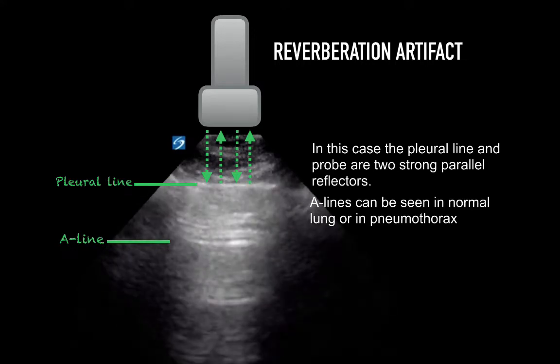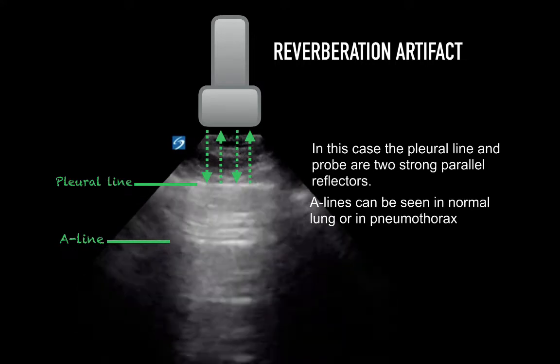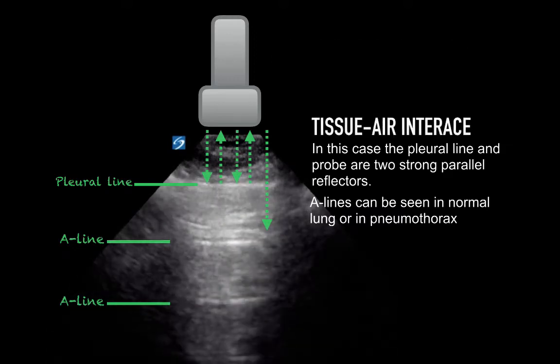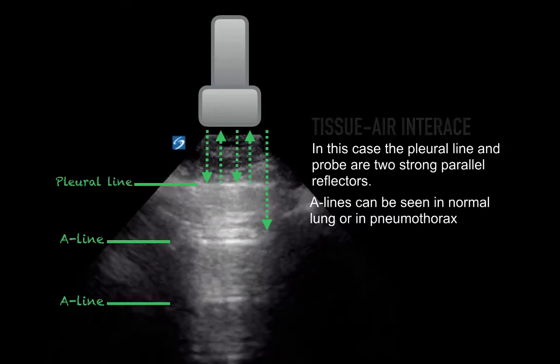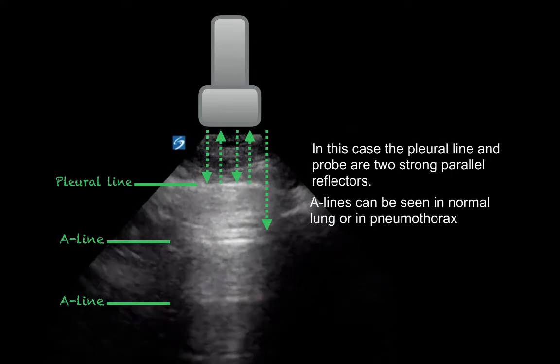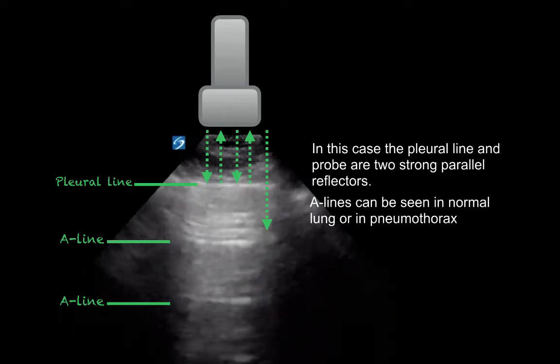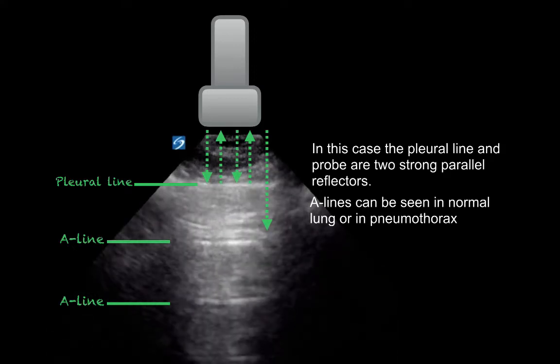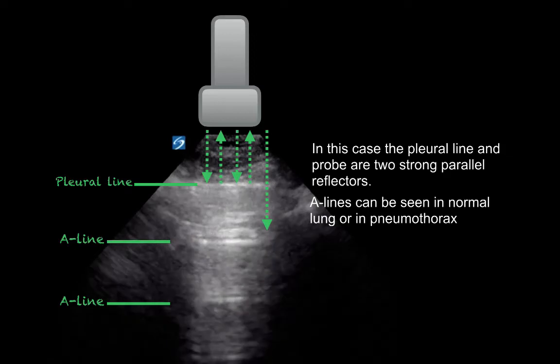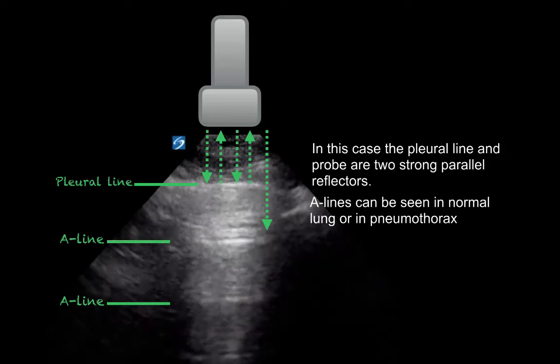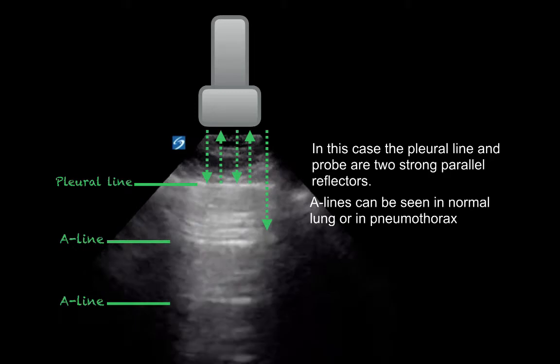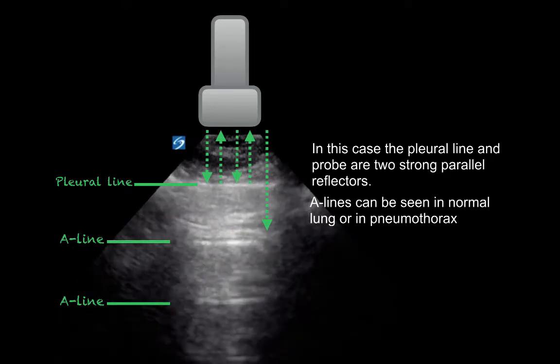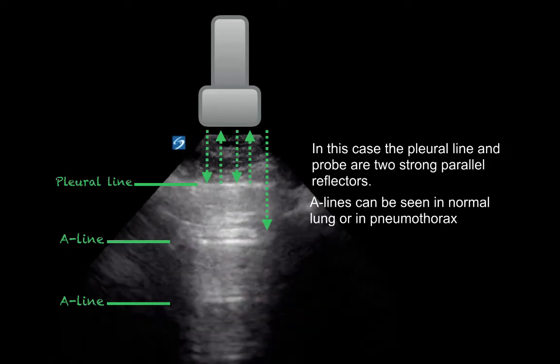This can happen more than two times — three, four, five, six times — resulting in multiple A-lines. A-lines are a reverberation artifact at the pleural line. This can even happen in the setting of pneumothorax, where again we have the pleural line and beneath it is just air. A-lines themselves do not exclude pneumothorax. However, generally speaking, you will not see the scintillating hyperechoic signal of the pleural line in the presence of a pneumothorax.